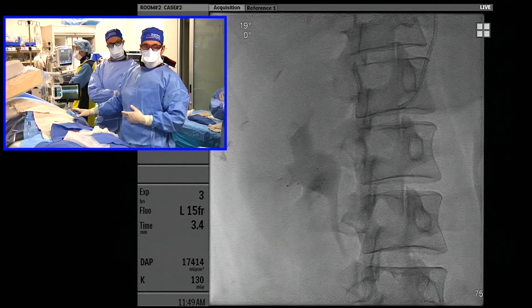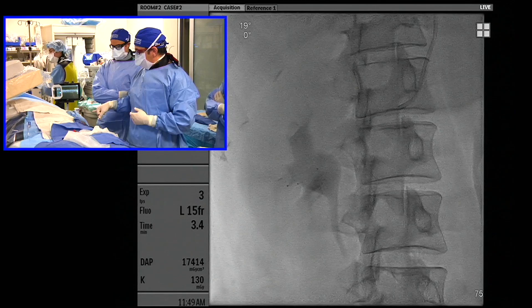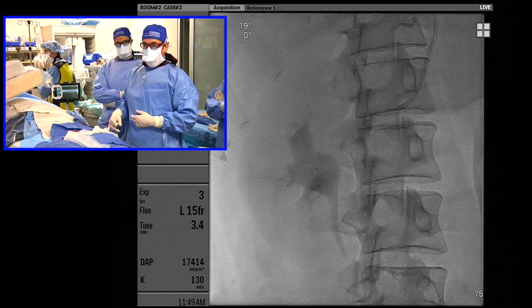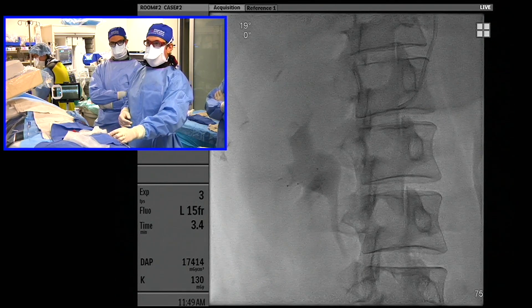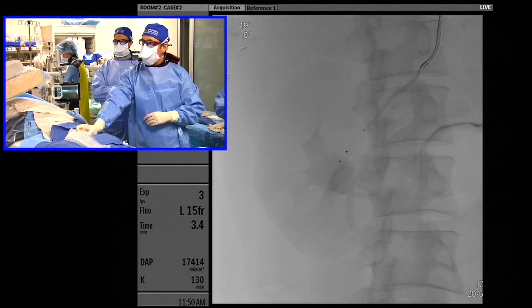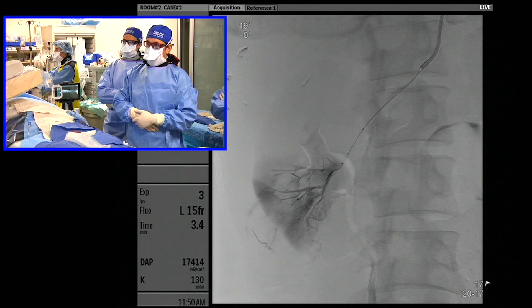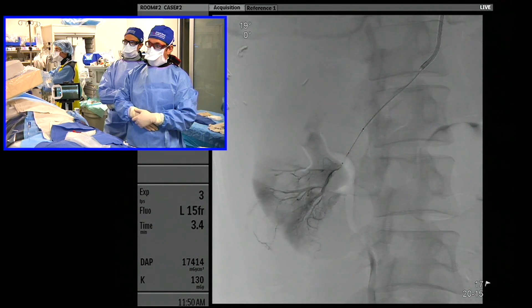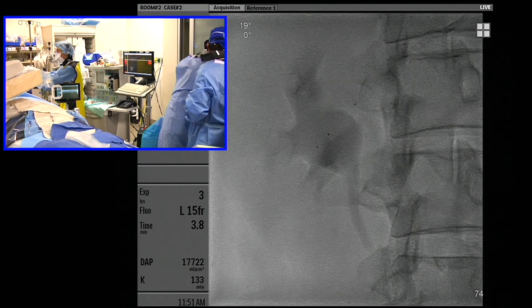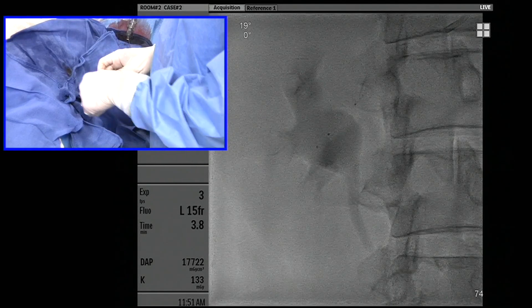To have a large guide catheter — we're not sure exactly how we're going to embolize this, but my initial thought, and this is what we've been doing for most of these, is to use Onyx, which is another reason I got this microcatheter. I like to be able to do runs around the microcatheter without taking it out — it's a much more stable platform when you use liquid embolic. I have a side flush here so I can do runs with the microcatheter in. It looks like there are two small feeders coming off this trunk, feeding the majority of the AML. We're going to do a run and then put the balloon up to see if it changes the flow.